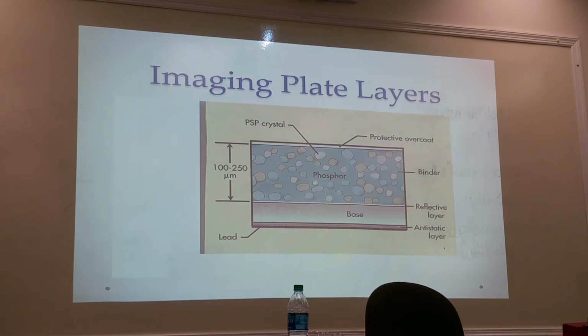So backscatter will come across. If you're doing a cross table, so your patient's laying on the table, your x-ray tube's out here and you're doing like a decubitus, x-rays hit that wall and will scatter back towards the image receptor. And you'll be able to see the hinges and stuff like that on the back. So that's why it's lined with lead. A little bit of lead.